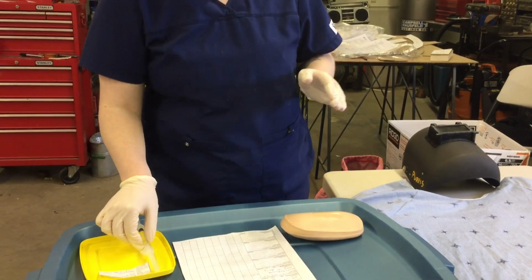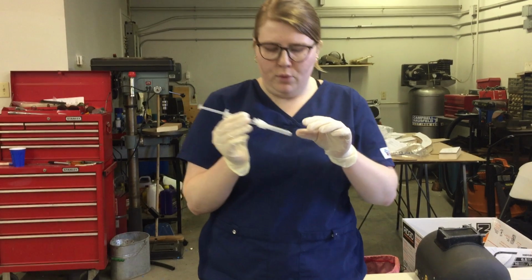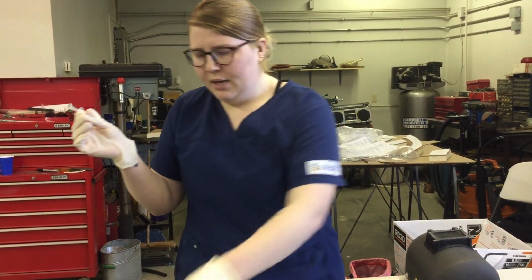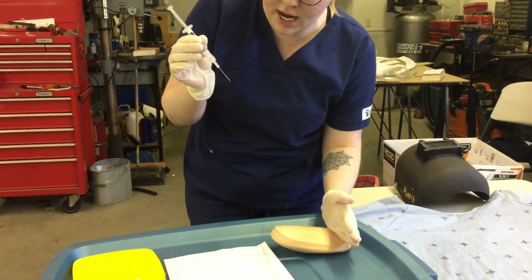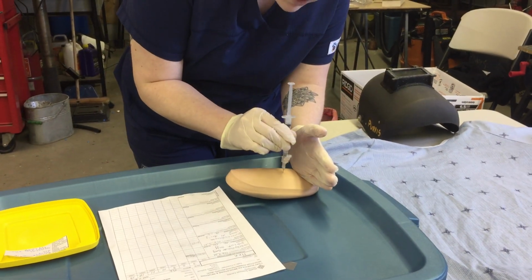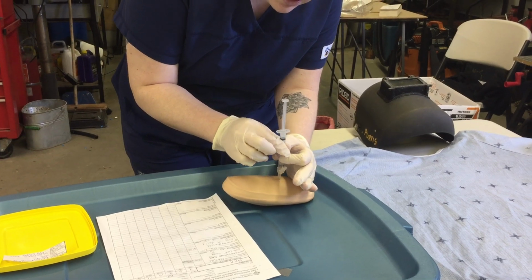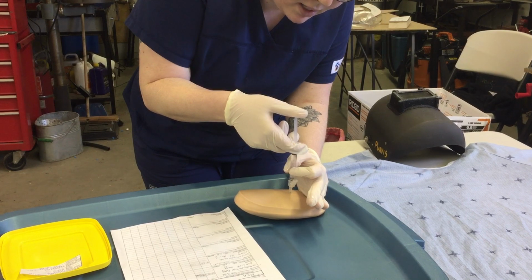So I'm just going to grab my syringe here and I'm just going to hold it in the right way here. And I'm going to remove the cap and throw that in the garbage. I'm going to push down on the skin and I'm going to slide it sideways to Z-track, and I'm going to inject at a 90-degree angle. And I'm going to stabilize, and then I'm going to slowly and safely inject my medication.